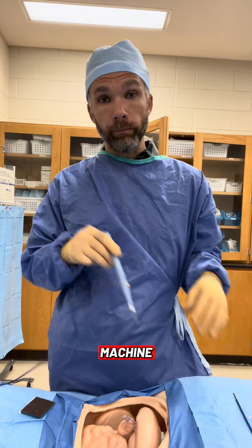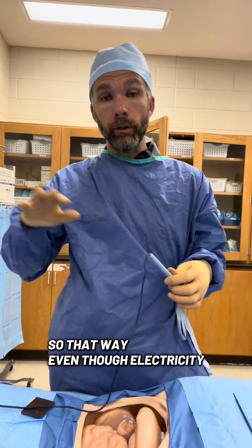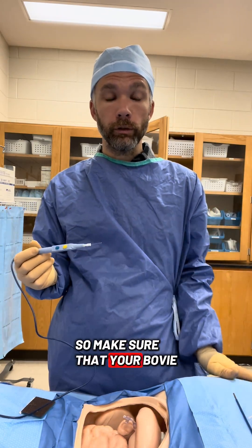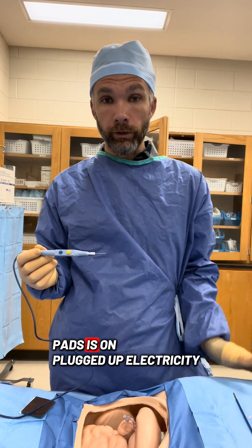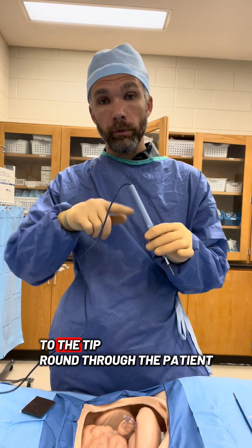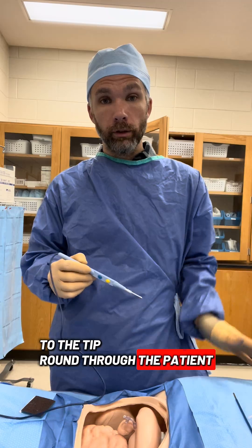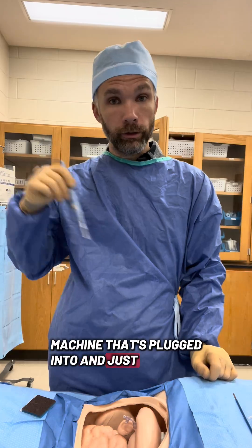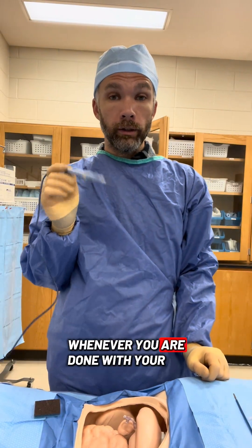The Bovie pad takes the electricity back to the machine. So even though electricity is running, you don't want to get shocked — make sure your Bovie pad is plugged up. Electricity flows from the tip, round through the patient, out the Bovie pad, back to the machine it's plugged into. It's just a circle.